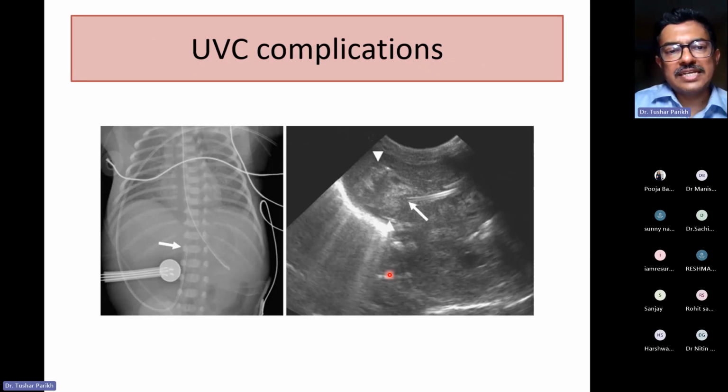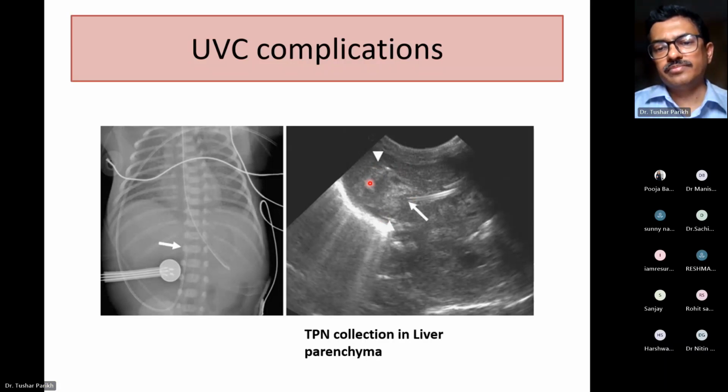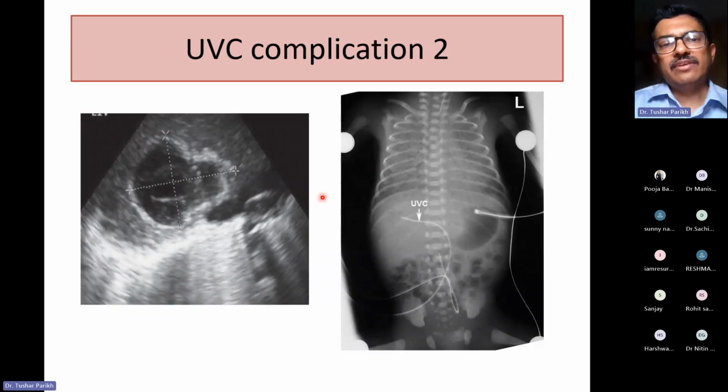Now complications, as I said. Here on the X-ray you see the umbilical line is stopping about 2-3 centimeters below the diaphragm, and one would say it is okay, acceptable, but in fact it has gone into the liver parenchyma, and here the TPN has gone into the parenchyma of the liver. So this is again not acceptable, and it can form an abscess like this.